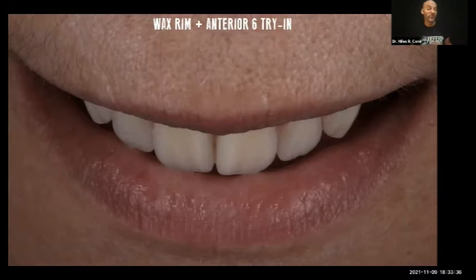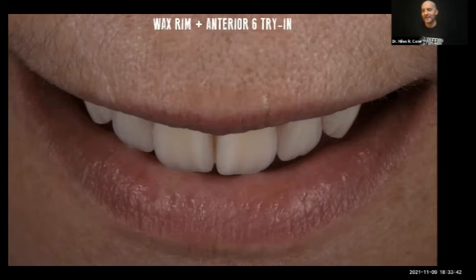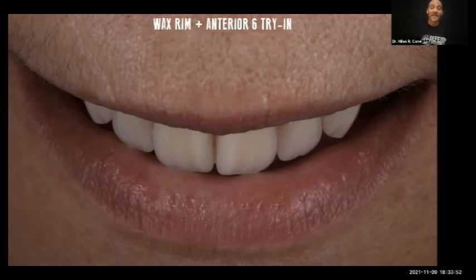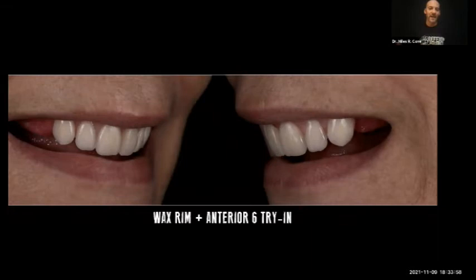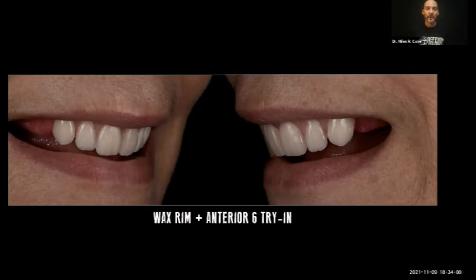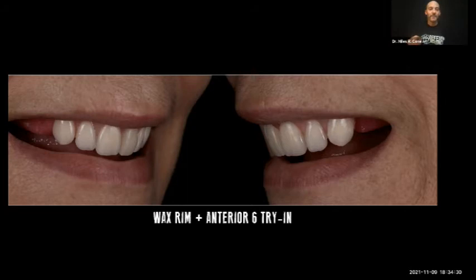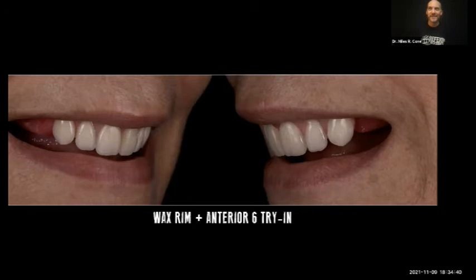As Dennis mentioned, I am a certified dental technician. Every now and then I like to set my own teeth — I always do the front six. Setting six teeth takes me like two hours because I try to be really particular about it. In this case, notice the wax is red, whereas the processed record base had yellow wax. A big part of the reason I needed that processed record base was because the triad wasn't stable — when the patient was biting down, the red wax was squishing. My denture technician recommended Gebdi wax — spelled G-E-B-D-I — which is bullet hard, so it doesn't smear when patients bite down.